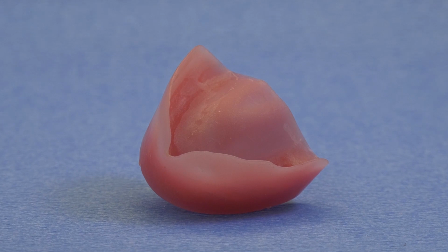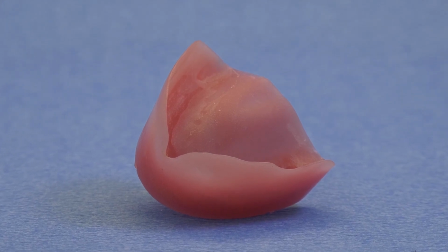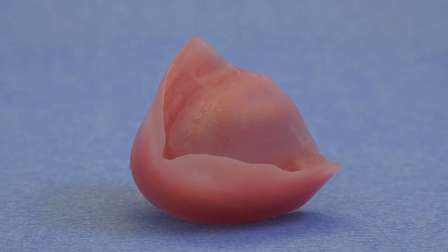If you're not sure of your bite, have a wax bite rim made. Take that extra step to have a good quality bite rim made and get that patient back to get a good bite. When you do that bite, make sure you mark that midline. Midline is very important. The midline of the frenum is not always the midline of the face, as you know.